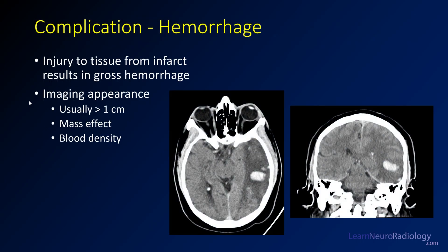Hemorrhage is related to the injury of tissue from an infarct. The vessels die, the tissue is dying. Because of that, the vessels can no longer contain the blood flow, and you can get rupture of those, and you can get gross hemorrhage into the affected area. Here you see an example — this is a left MCA infarct. We have this large region of hypodensity in the left MCA territory, and centrally within that, we have some mass-like areas of hyperdensity, hyperattenuation, and you see it again on the coronal. That's an area of hemorrhage.